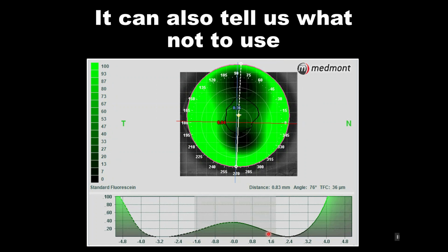And in the case of our pellucid patient, the contact lens software is saying that it would be very difficult for this corneal GP to actually work on this eye.